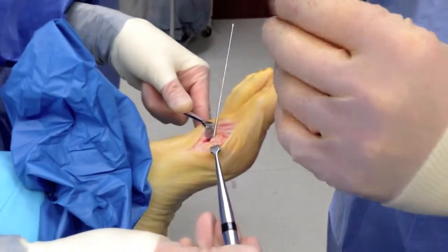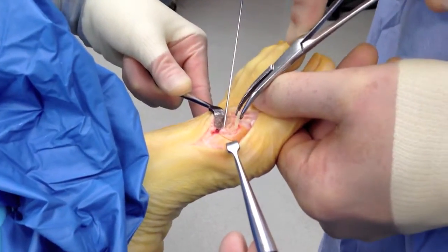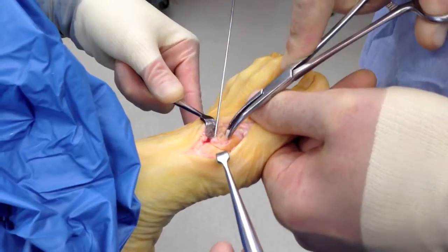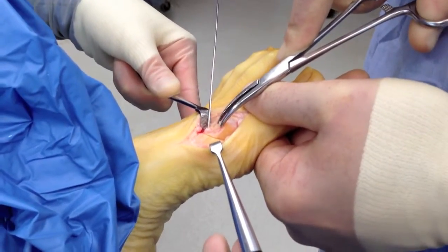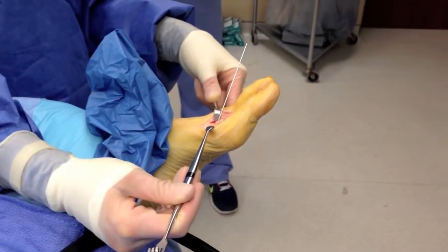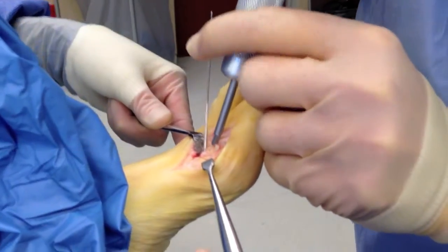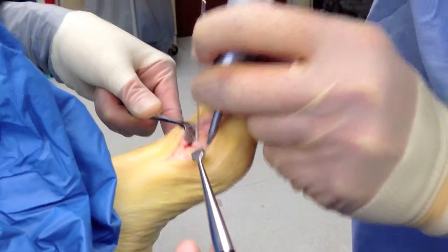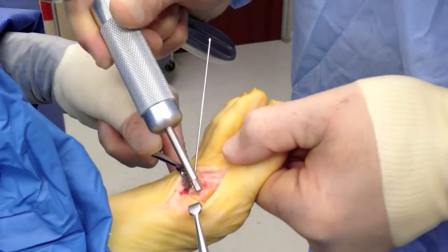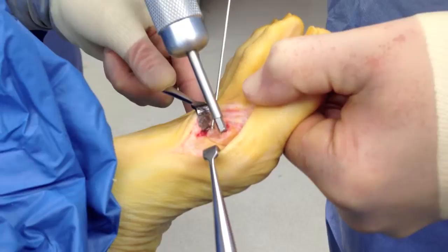Now we're going to put the allograft in — the Solana nail — and it pretty much slips right down. We can get it in the first few millimeters until it gets to that little fin area where it will hang up. Then I use the tamp to take it down the rest of the way. I suggest tamping it downward so you don't snap the head off. You can see it's flush now — it goes in real nice. That fin hangs up right about here to keep it from sliding back and forth.